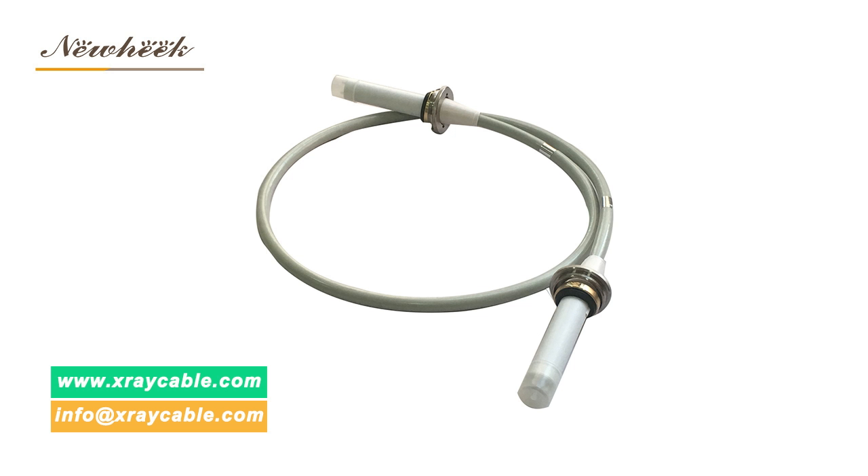How long is the high voltage cable on the U-Arm? Nuheek's U-Arm is equipped with an 8 m high voltage cable as standard.